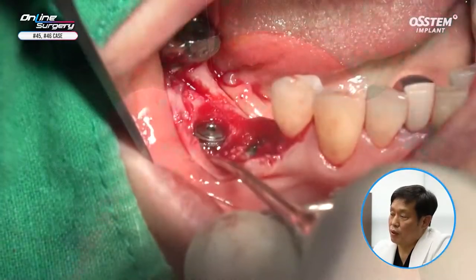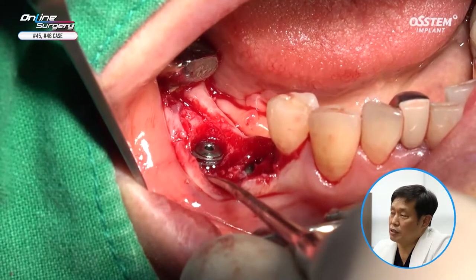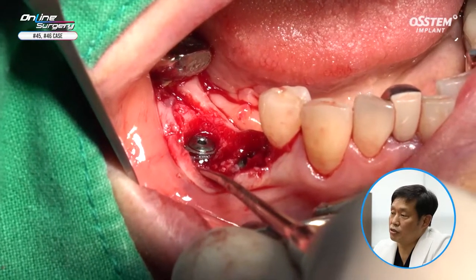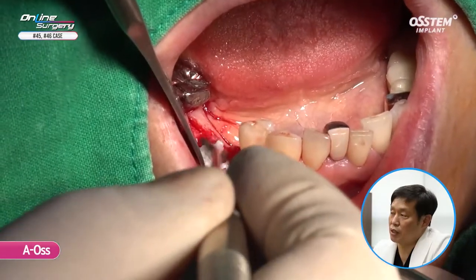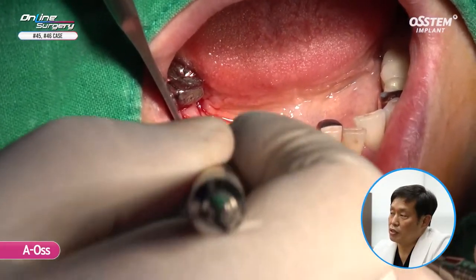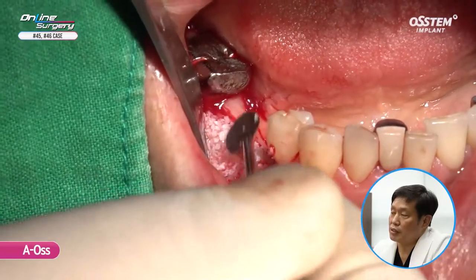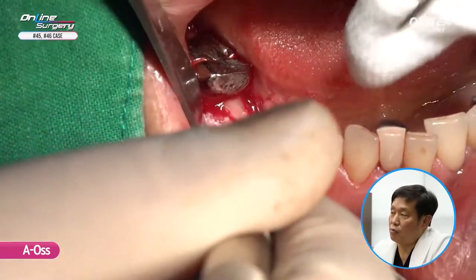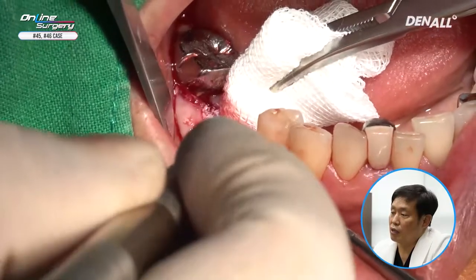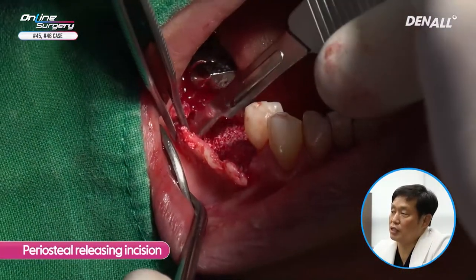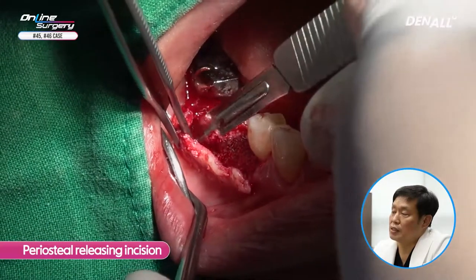Looking at the buccal side, thread exposure can be observed. AOS was used to do additional GBR. Bone graft was performed on top of the implant and on the buccal side. Periosteal releasing was done and suture was done.